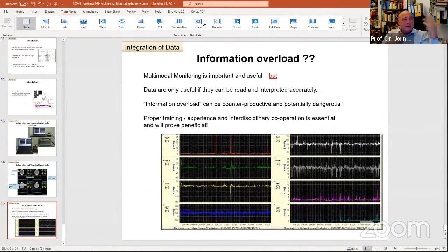When the patient is bad, had trauma, and you expect the ICP to be high but don't have a monitoring system, put a drain in and put a pressure transducer on. Easy, and you can have a measurement. The problem starts when the CSF is out and you don't have any ventricles to measure. Then it doesn't work.